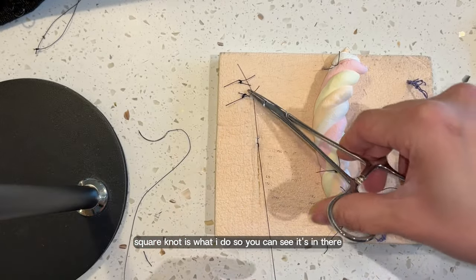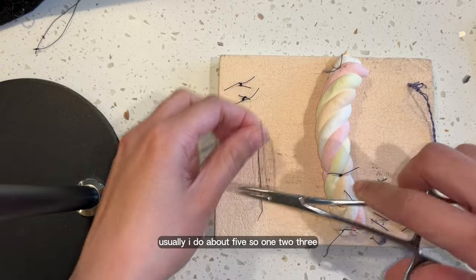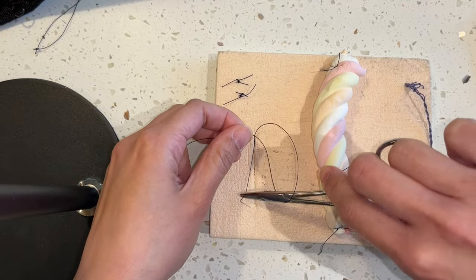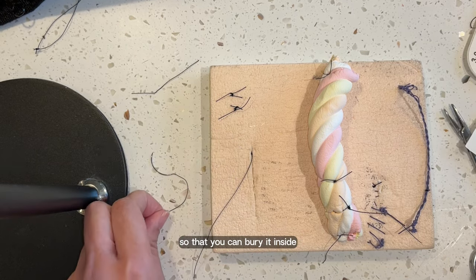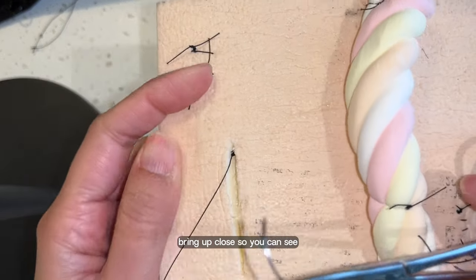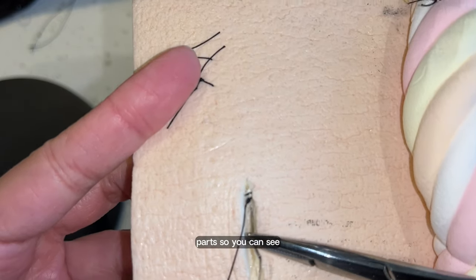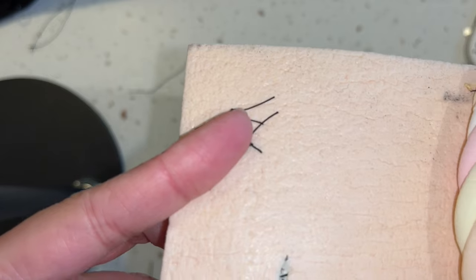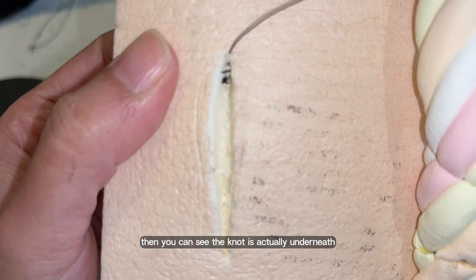You want to go all the way down there. Usually I do about five — one, two, three, four, five. Then you cut this one really short so that you can bury it inside. To bury it, hold your needle, bring it up close. Go underneath the knot and then come out at the commissure part — not onto the orange bit, but still the white bit, still in your dermis. So then you can see the knot is actually underneath — it's buried.